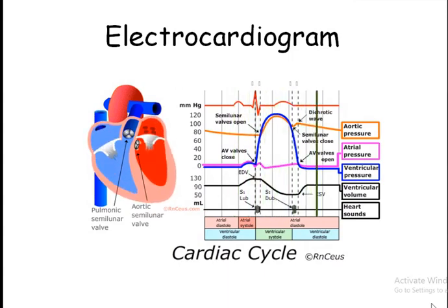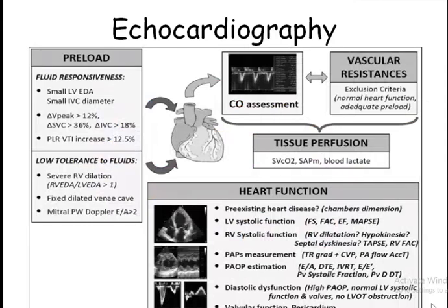So this is one of the most important non-invasive methods through which you can assess the condition of the heart. Another one is echocardiography. Although it is a specialized investigation usually done by a cardiologist, in ICU, in critically ill patients, it has now become a mandatory tool to be used by all intensivists. It has become like a stethoscope.